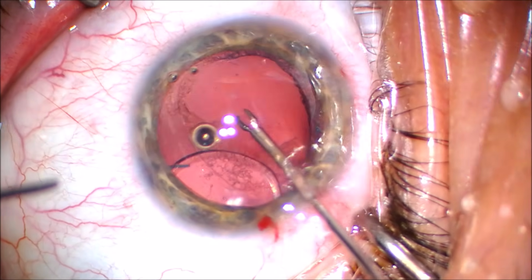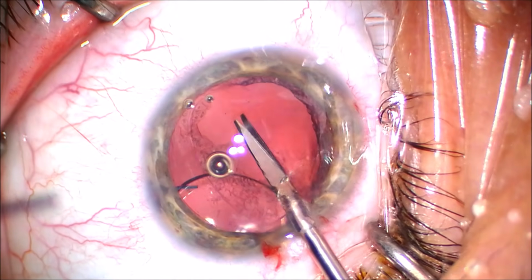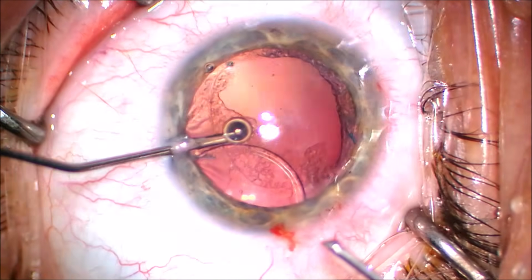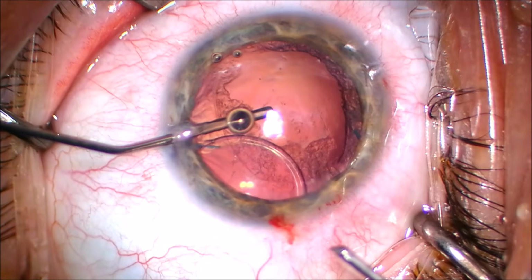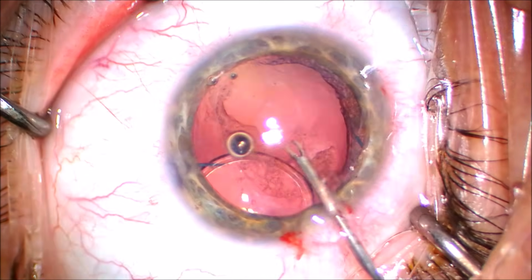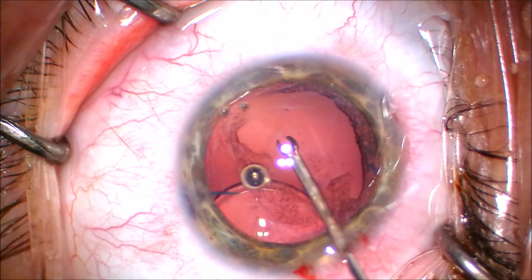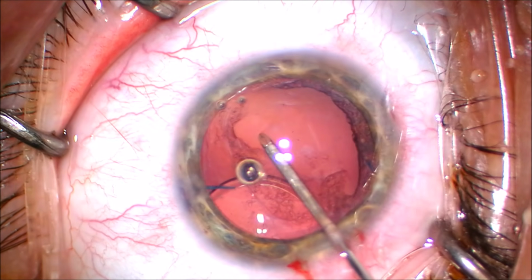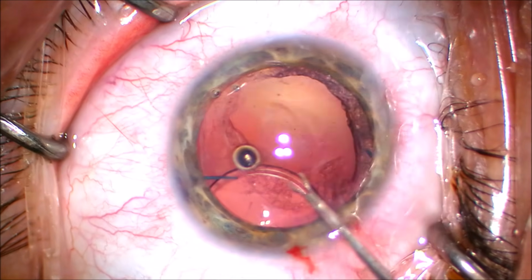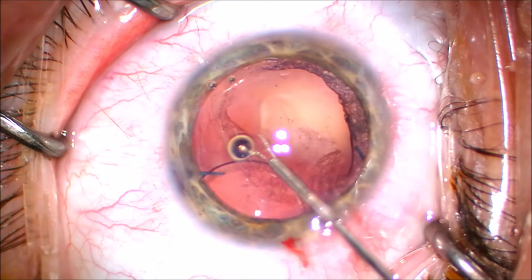So this is when I realize I have to just cut the posterior capsule and then make a sharp edge to create the flap. I'm pushing a little dollop of dispersive viscoelastic underneath the hole as well, just to tamp out any potential vitreous. And remember, I'm actually doing this posterior capsulorhexis with the IOL in the eye. So it's a little bit of a tricky maneuver. You can see how large this patient's sulcus space is because I'm able to push that lens out of the way.